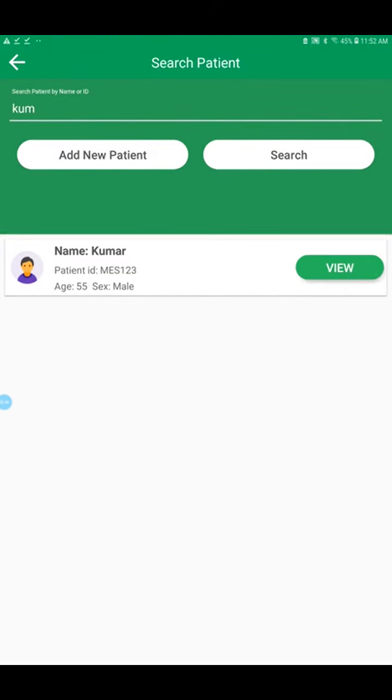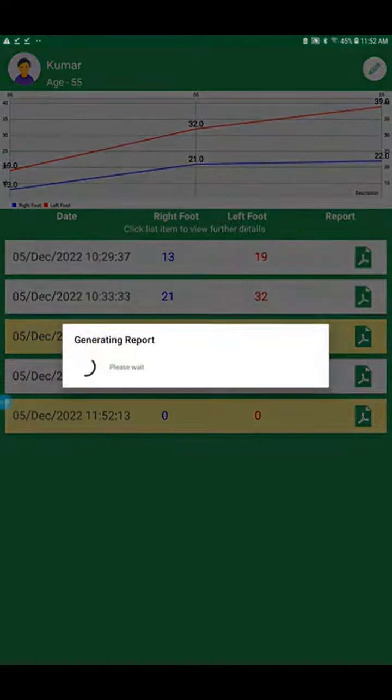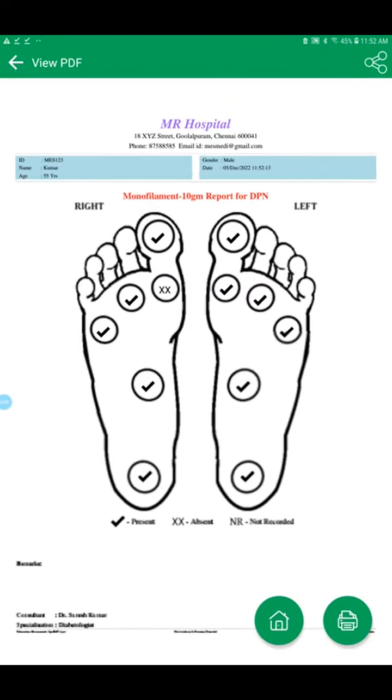So it gets saved. If you see here, the white represents Biothesiometer, the yellow represents the monofilament, and all the values will also be 0, 0. If you select the PDF, then the PDF is generated. In the PDF you will get the values. You can see in the first metatarsal head I selected red, so red means absent, so here it is a double X. All the other points have the tick mark.